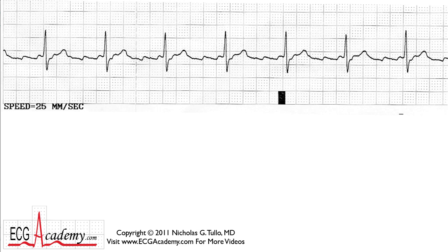So we have a regular rhythm at 68 beats per minute. Now of course what we should do is look for atrial activity — what's the atrium doing? The best place to look for P waves is in front of the QRS complex. If you look in front of this QRS, there's a bump right here that kind of looks a little like a P wave. Looking at the next QRS complex, it seems like there's the same signal there, and there's a bump in front of every QRS complex. If this was a P wave and you were to measure the PR interval, it would seem to be somewhat short — perhaps 120 milliseconds or so.